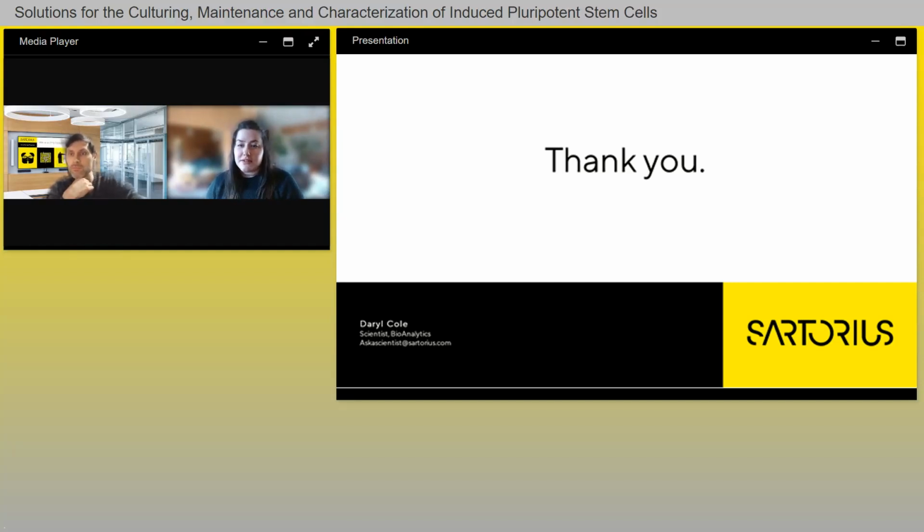It says, what are the effects of different culture media formulation on iPSC population? So the example that I showed during the webinar, we get changes in morphology and also a reduction in the iPSC growth. iPSCs tend to grow fairly quickly, and due to their pluripotent nature, you're able to keep growing them much like a cancer cell line.